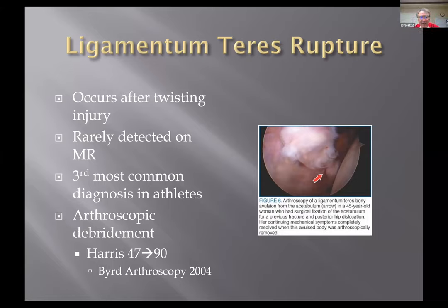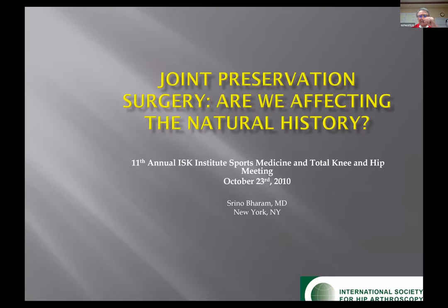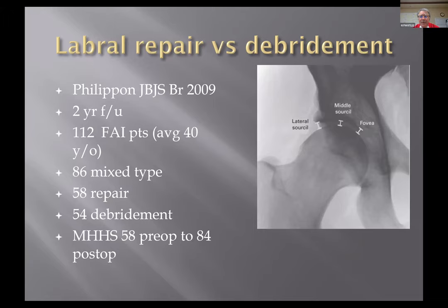This is just a ligamentum teres tear. This is a crazy surgery to fix this. There are guys that run a drill through the femoral head with a graft, and then they swivel a button, an endo button on the inside of the acetabulum. I don't even think Dr. Jones does those, but you can actually do those. Philippon and Ben Dome do those things. Holy cow. So are we affecting the natural history of the hip? That's the key. Our job is to get them to age 80, maybe 90. Again, we're trying to fix labrums. We're trying to show that that isn't good.